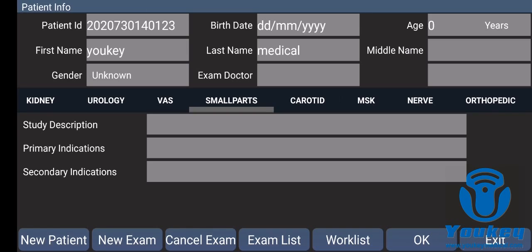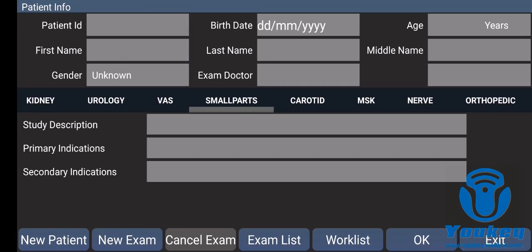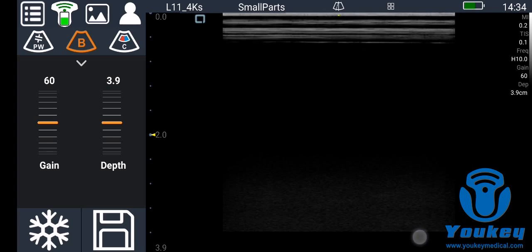After you complete the exam of this patient or create a new patient, then click OK.